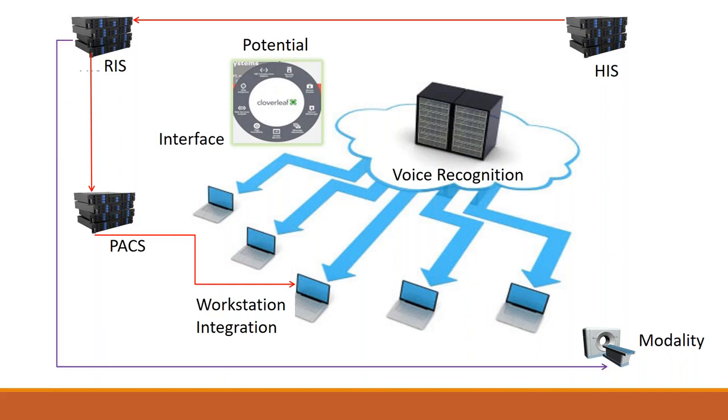Modality gets its information from the RIS. You see that purple line that just came in. So your DICOM modality worklist is built from the information based out of the RIS. When you finish your modality, the images go to the PACS system.